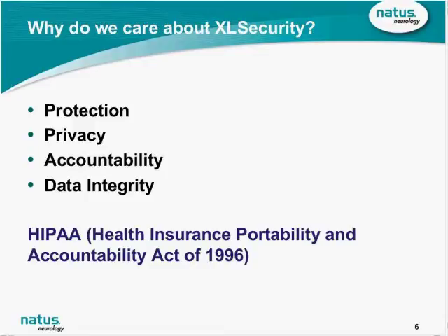It seems to make sense that even if you aren't required to comply with HIPAA, you would still be interested in protecting your data and holding people in your lab accountable for the information that is entered. We often get asked, is your software HIPAA compliant? What we generally say to that is, it's not that the software is HIPAA compliant.